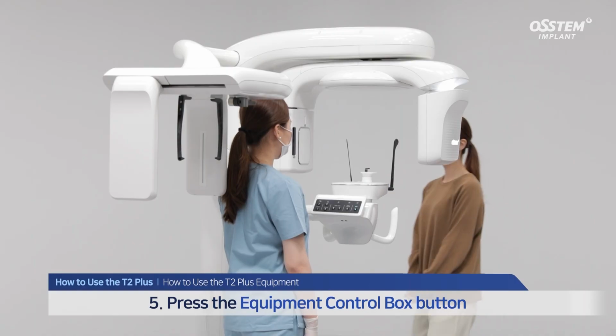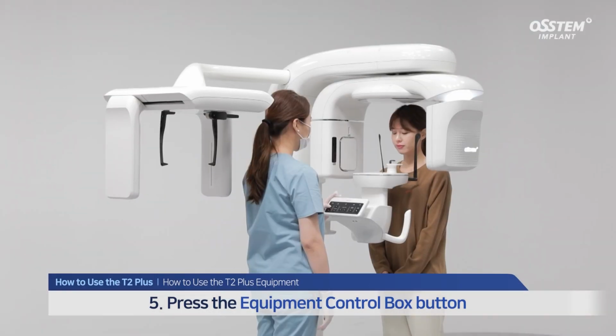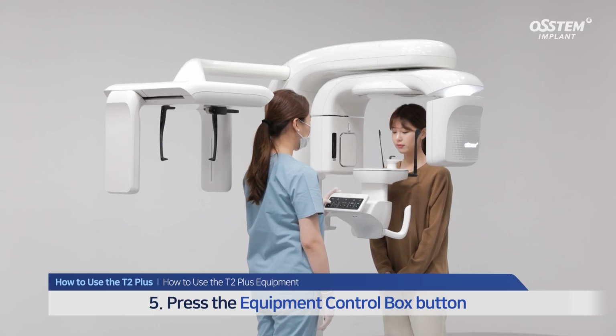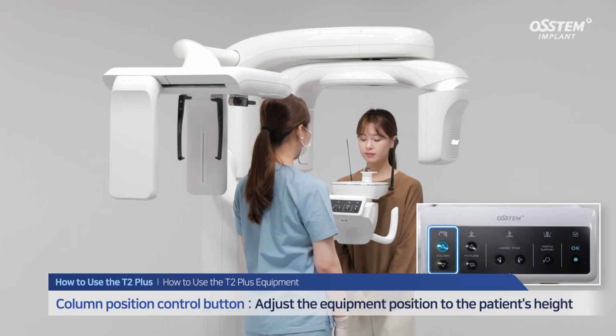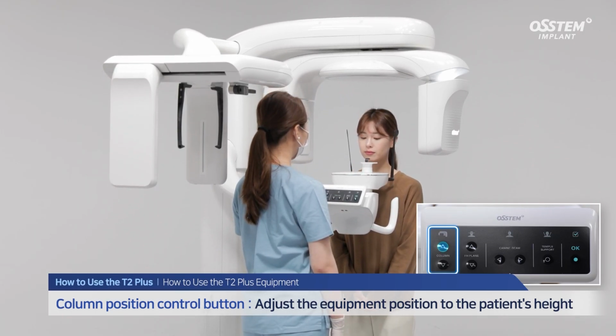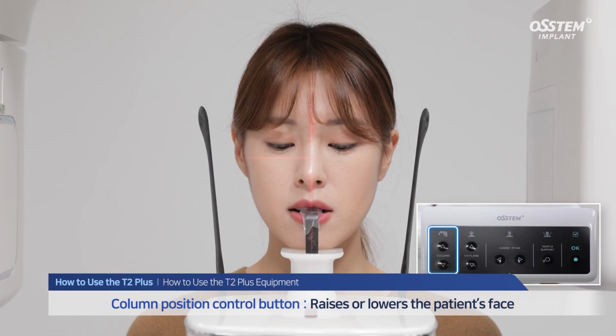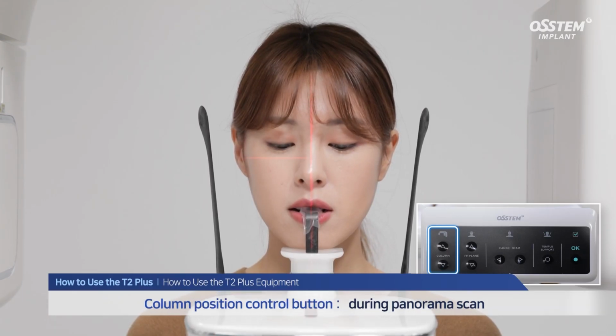To position the patient for scanning, press the equipment control box button and check whether the equipment works properly. Using the column position control button, you can adjust the position to the height of the patient. During a panorama scan, adjust the Frankfurt beam to the baseline under the eyes. Then, raise or lower the patient's face using the column button.